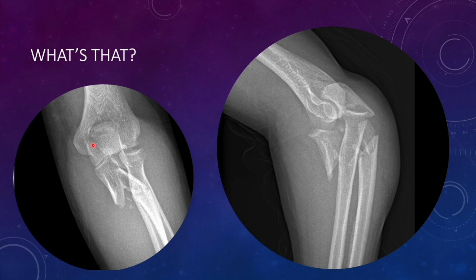So in this AP radiograph, you see some part of the proximal ulna is articulating with the distal humerus, while the remaining part is not aligned. That means it has subluxated. The radial head and the capitulum relationship is also somewhat disrupted in AP view, but when we see the lateral view, the radial head is actually posteriorly dislocated. It should have been lying somewhere here. Now it is dislocated posteriorly.